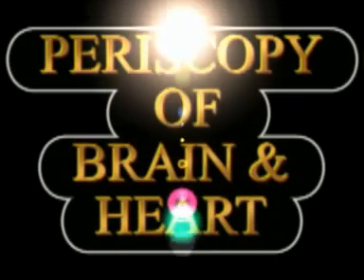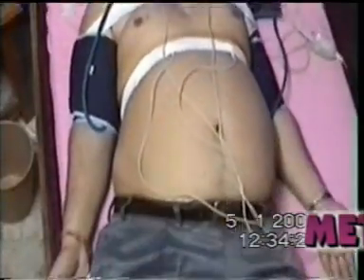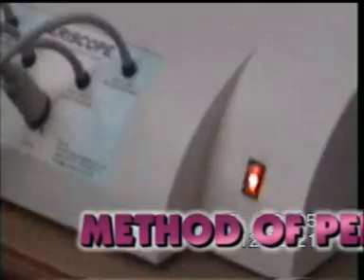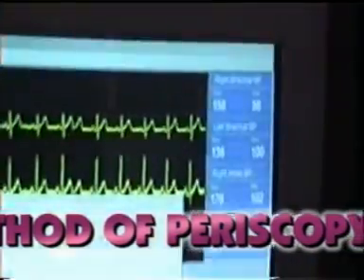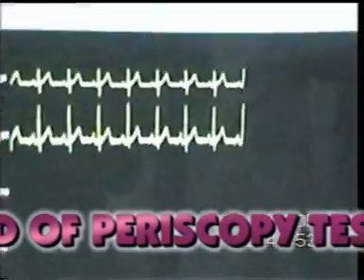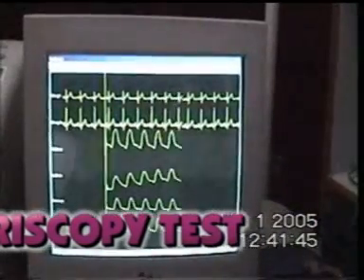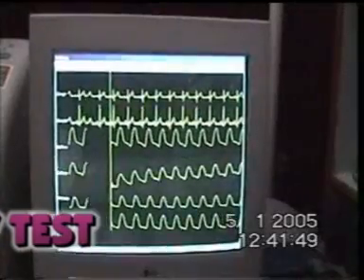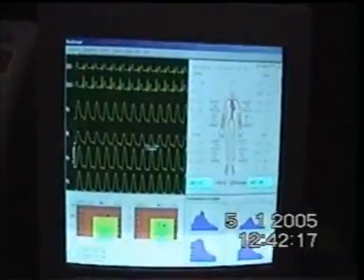Periscope is a non-invasive, multi-parameter, comprehensive cardiovascular analysis system. By simultaneously measuring arterial stiffness index, ankle brachial index, pulse wave velocities of limbs, carotid femoral pulse wave velocity, brachial ankle pulse wave velocity, and pulse pressure.